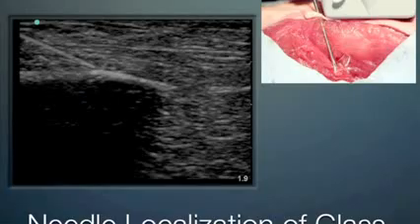Place another foreign body to find the foreign body. In this case, we take a needle down to this glass. So here's a needle coming in here. It reaches where the glass is, and then at that point we can use that needle as a marker for where to place the device to grab the foreign body. This is just a tissue model here demonstrating this.